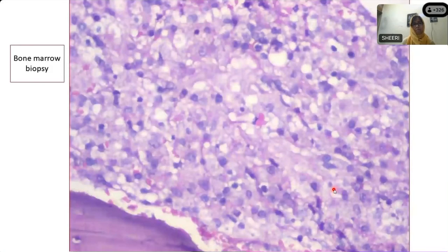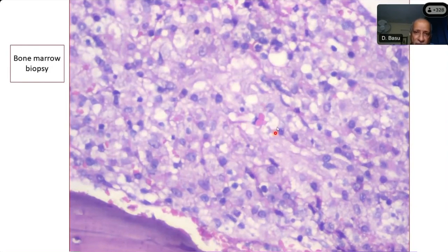This was the trephine biopsy. I think again this picture was sent to you. Yes, sir. This trephine biopsy again shows, what does it show? Sheets of macrophages can be seen on this part. Foamy, bubbly macrophages. What is this? So this is an activated plasma cell. So what does it show?